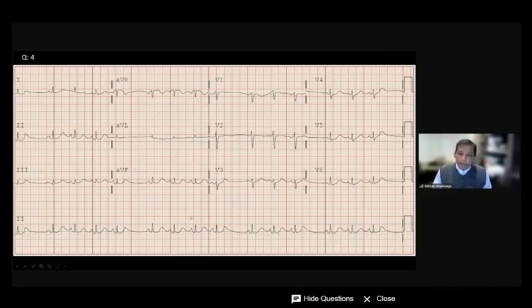Again, when you have an ECG, I think since most of you missed it, I'll have to go back and say what's the basic part that you missed. First of all, we all see there's a pattern of beating. There are four beats, a gap, four beats, a gap, four beats, a gap, right?